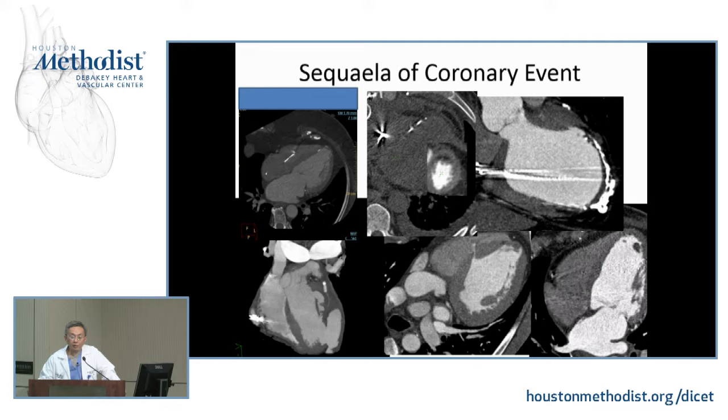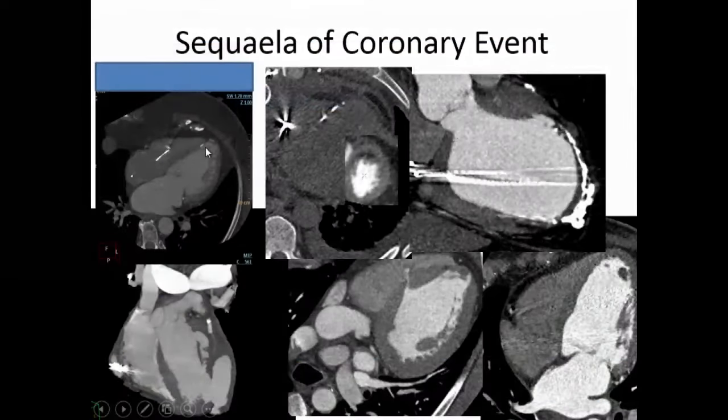We are not only able to look at the coronary stenosis, the plaque, and the distribution of the vessel. It's very important for you to pay attention to the heart outside the coronary tree. Okay. This question goes for Alpana. What do you see here? What does this image help you decide, if the coronary artery is normal or abnormal, before you even look at it? Is this a normal finding here, right here in the apex?